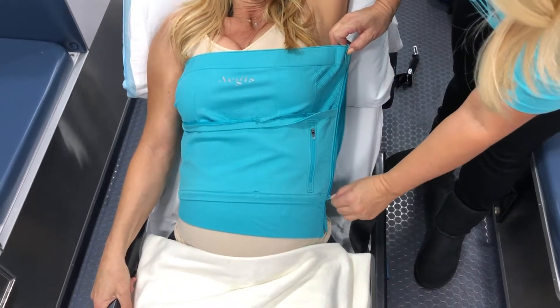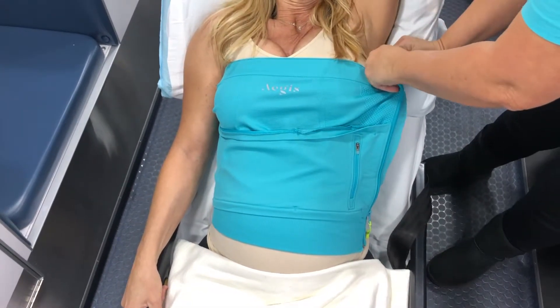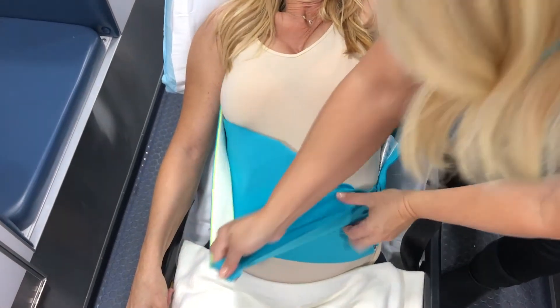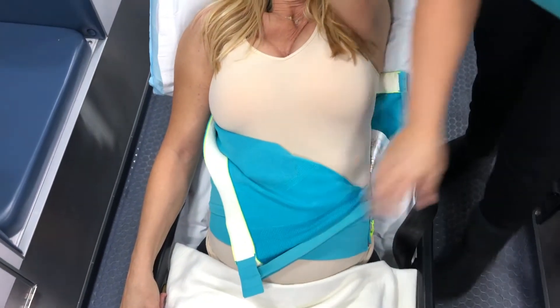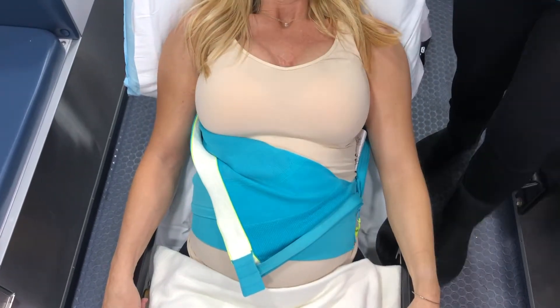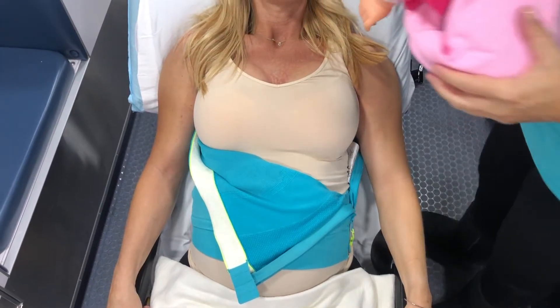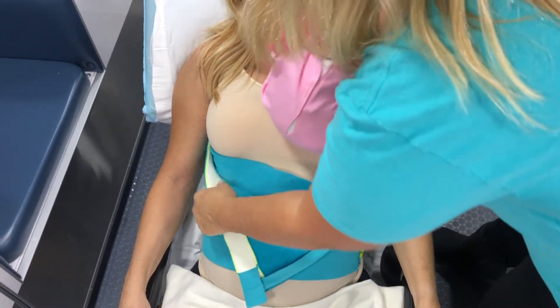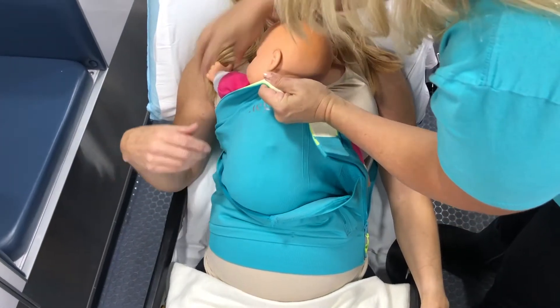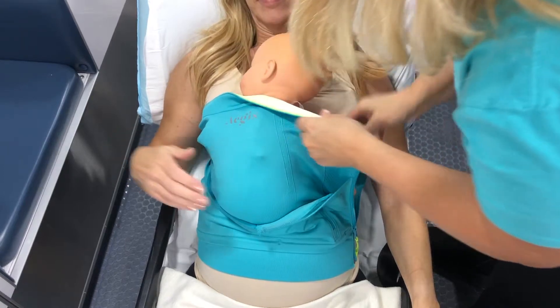To secure the infant in the Aegis Wrap, simply pull down the zipper halfway and release the top eye hooks. Pull the top corner of the wrap diagonally across the mother's torso. Place baby chest to chest on mother in a frog-legged position. Infant's face should be turned to one side, visible and kissable. As mother holds infant in place, re-secure the top eye hooks and zip up the zipper.